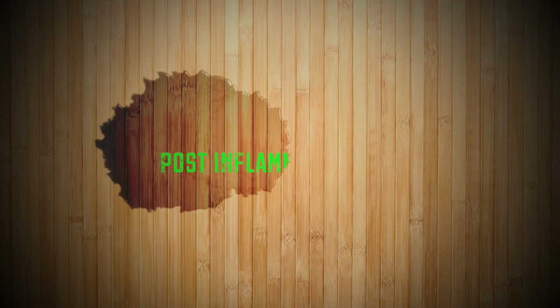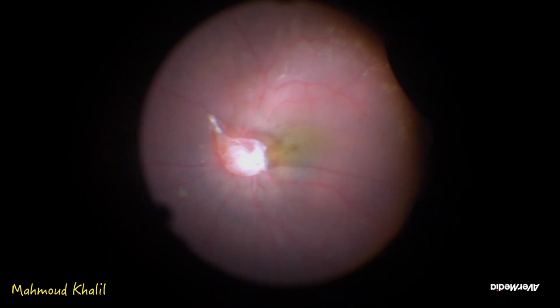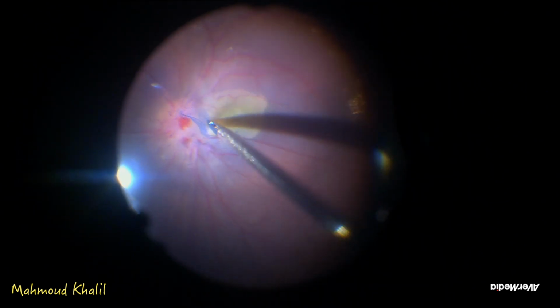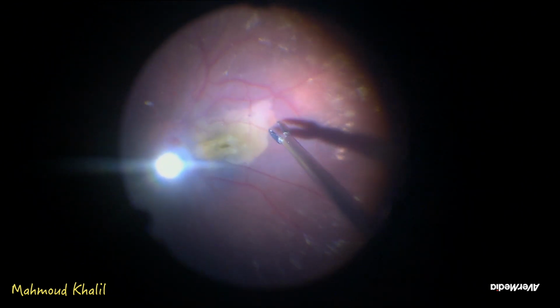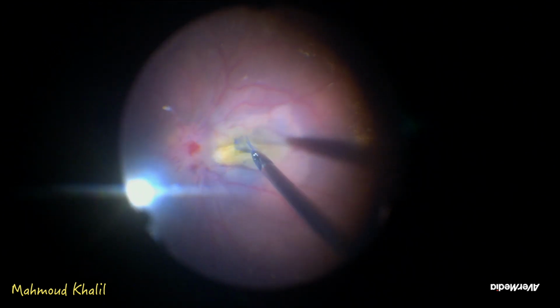The fourth video is an epiretinal membrane secondary to uveitis. This patient was a child with uveitis with an epiretinal membrane present over the disc and also extending over the surface of the macula. After removing the epiretinal membrane, then staining the ILM and starting to remove the ILM. In this case, the retina is edematous, friable, so be cautious when removing the ILM. The ILM itself may tear the retina, and also there is no adequate support of the retina because the retina is mobile.